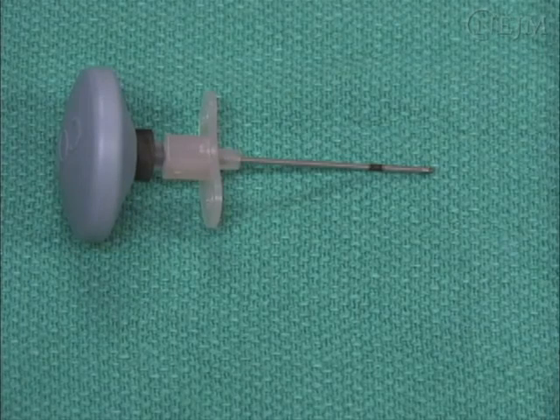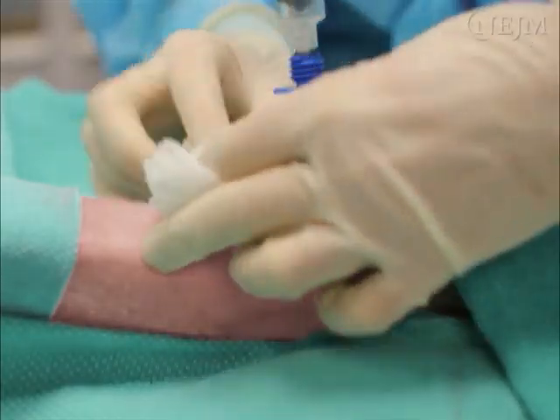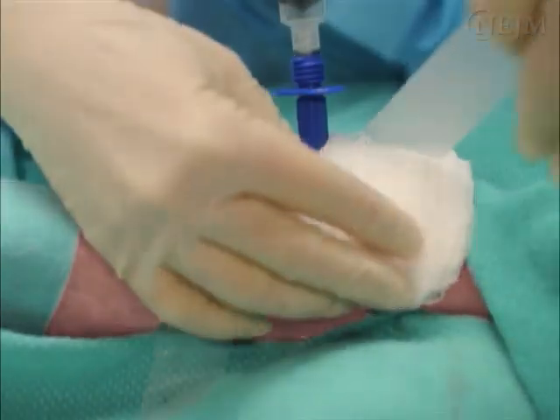Through and through penetration of the bone can be avoided by using the depth markings on the needle and by placing the index finger about 1 centimeter from the bevel of the needle. Secure the needle with bulky gauze dressing and tape.